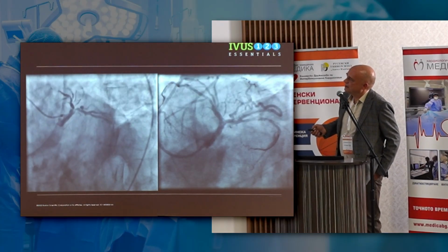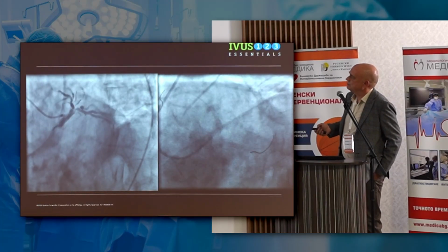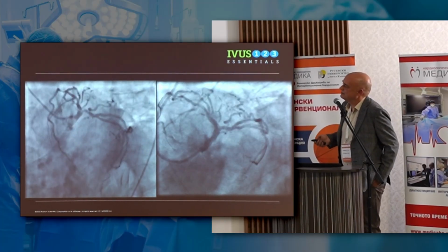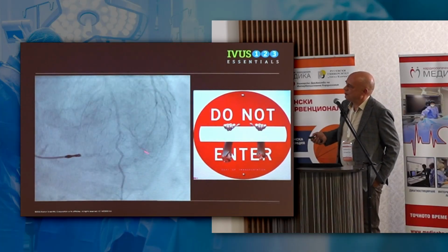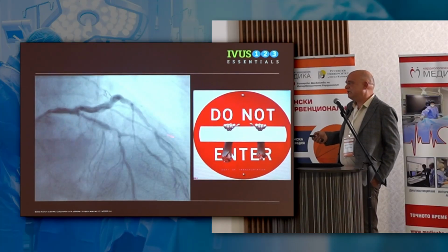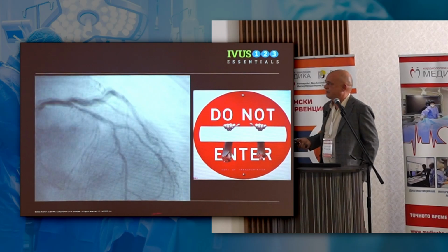Also here, we have a heavily calcified left main, and this was a problematic final result regarding the stent expansion and apposition. In the next few angios, these are patients for whom I had only the diagnostic angio, so we don't know if that patient went to the CABG group or the PCI group.